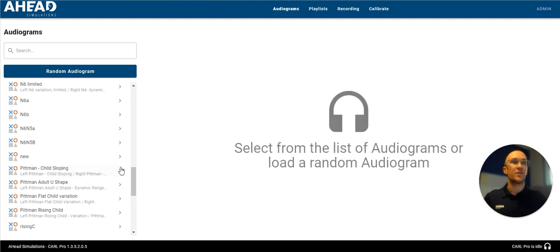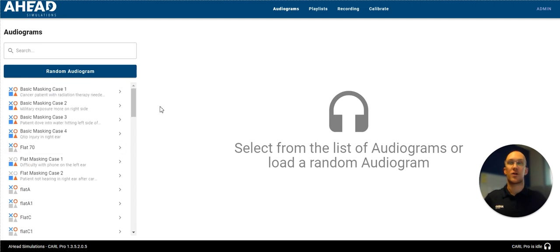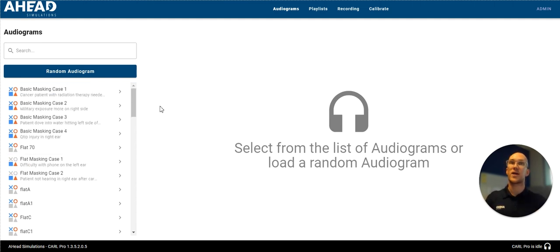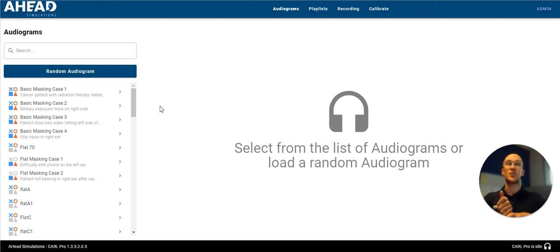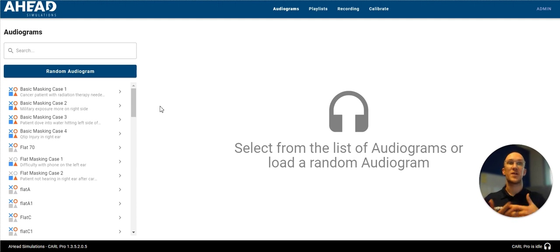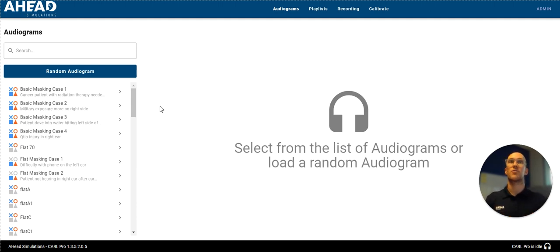To what you can do with your Carl Pro and a few recommendations to get up and going. Again, number one, switch the ear that came with your Carl. Number two was record. Number three was calibrate your Carl. Number four, create your own audiogram. And number five, test Carl's hearing.